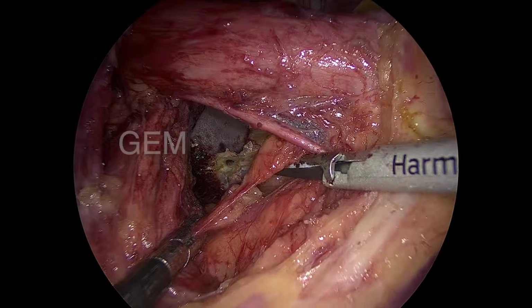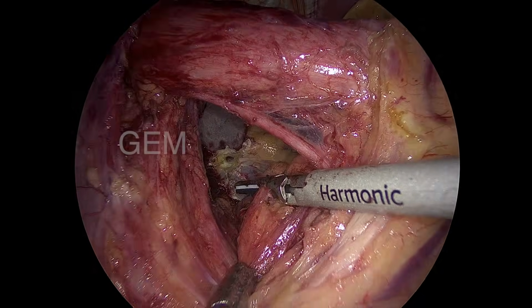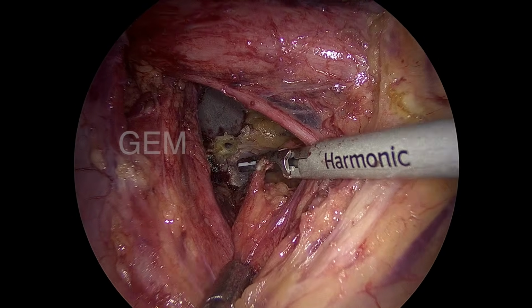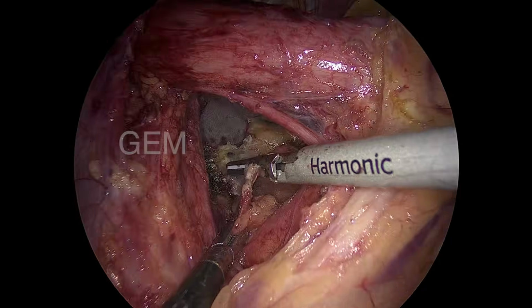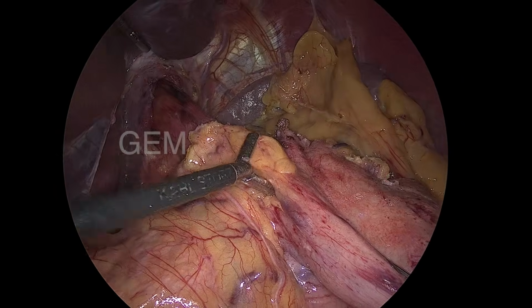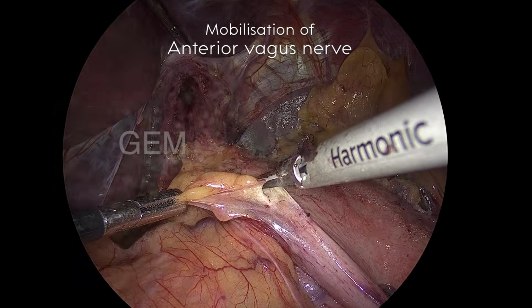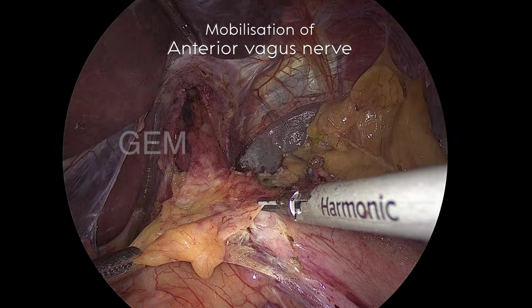So now you can see this small vessel is there. It may be the posterior branch, the posterior gastric branch from the splenic artery. So now this is the time for mobilizing the anterior vagus along with the OG junction pad of fat.